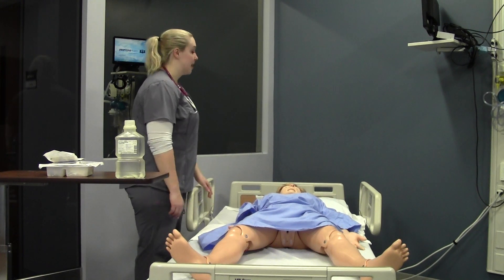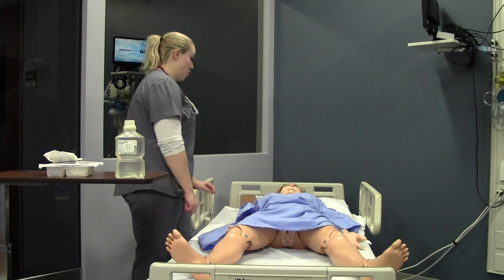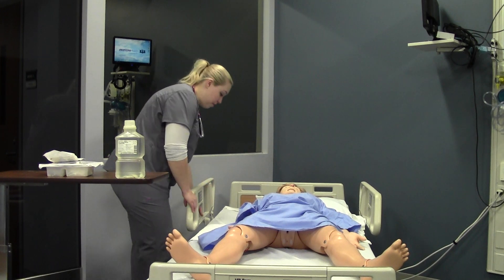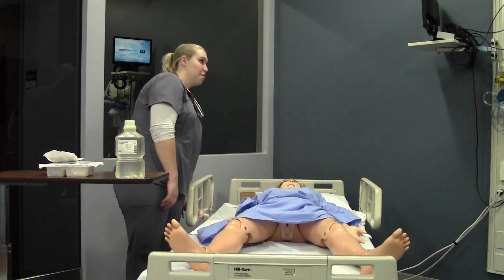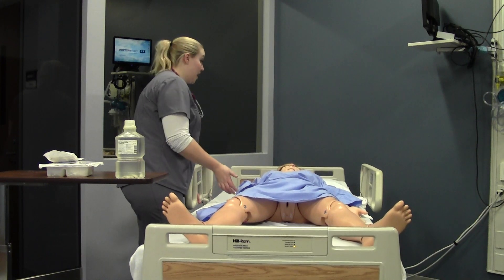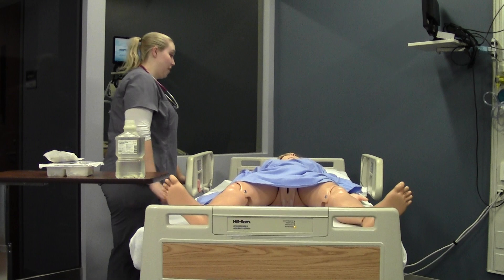So Mr. Smith, my name is Erin. I'm going to be your nursing student today. Today I'm going to be performing trach cares — we're just going to suction your trach, clean the inner cannula, and put it back. I'm going to lift the bed up to waist height. This procedure takes about 20 to 30 minutes. If at any time you need to stop, feel like you can't catch your breath, please go ahead and raise your left hand.